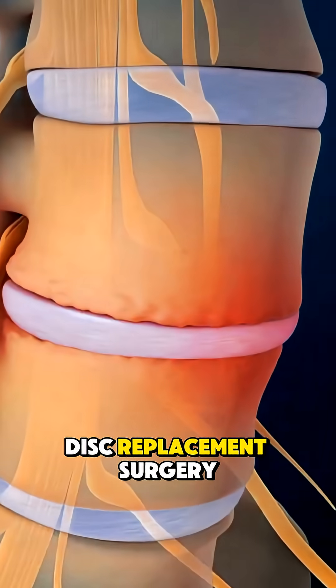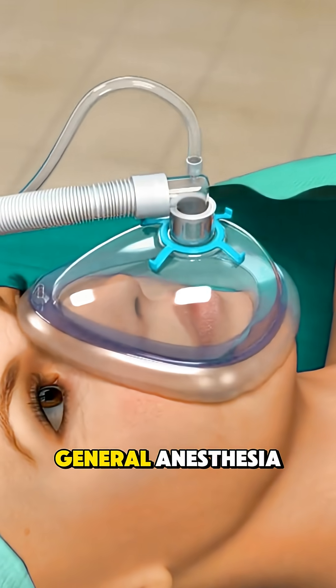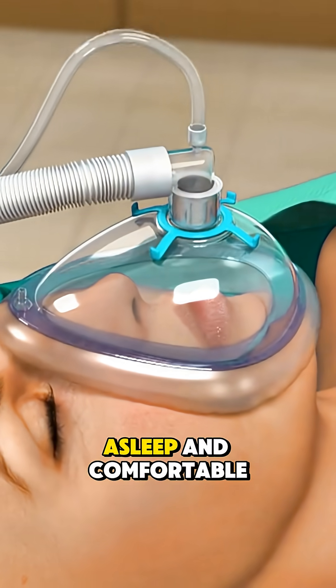Ever wonder how lumbar disc replacement surgery is actually performed? It begins with the patient under general anesthesia, so they're completely asleep and comfortable.